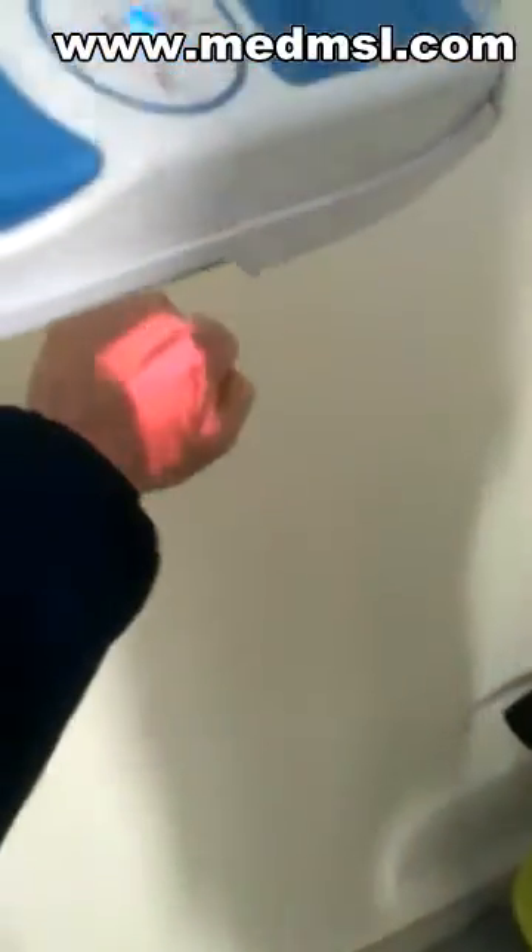Just put your hand somewhere on your body under the scanner and you'll see your vein right away. You see, right? It changes colors all the time.